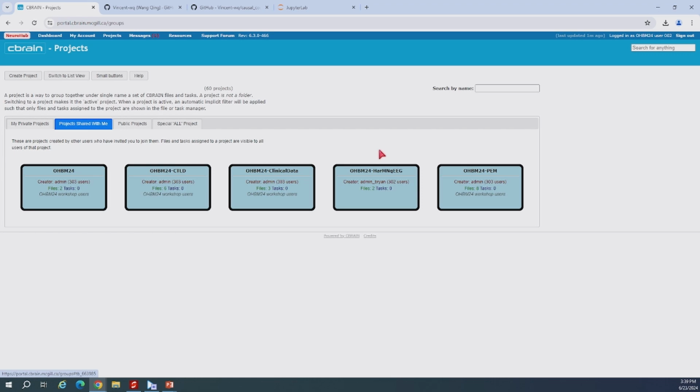at the scalp. Even with the harmonized qEEG at the scalp, as you saw in Pedro's and Maria's presentation, using the full cross-spectral matrix for the qEEG analysis increased dramatically the classification power of the EEG.